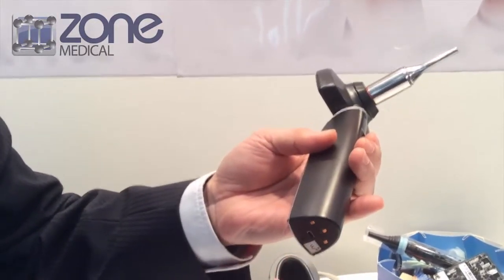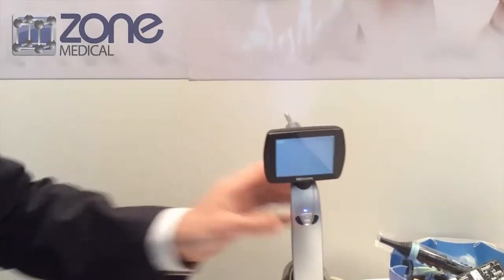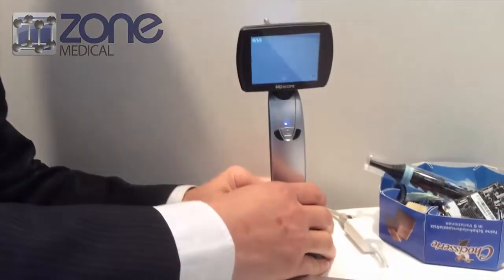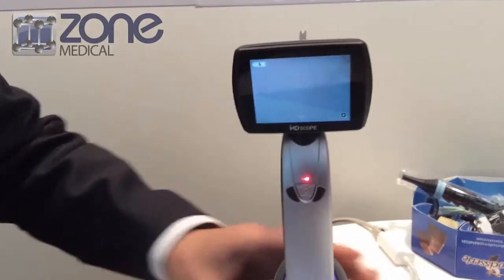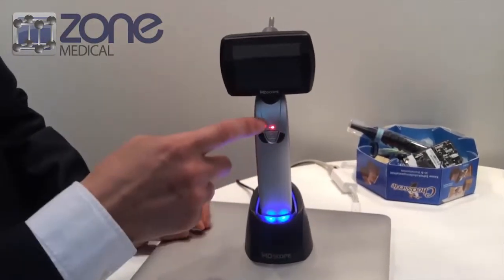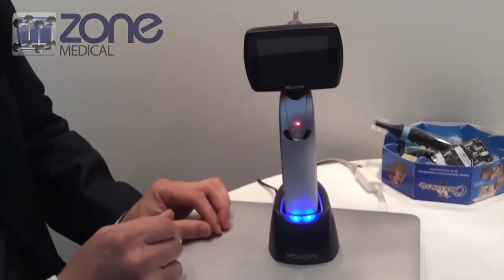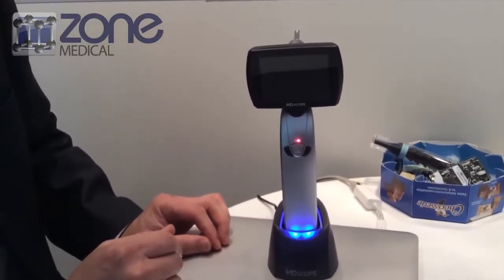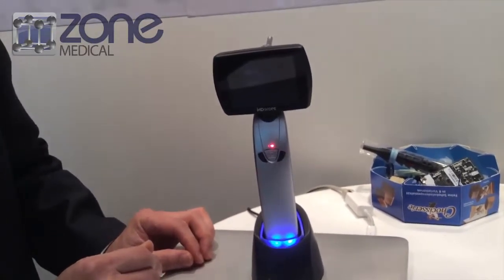One port has three functions, and we will provide two different cables. For charging, once the charging is complete, the LED power indicator will turn off. You can charge it and use it at the same time — yes.